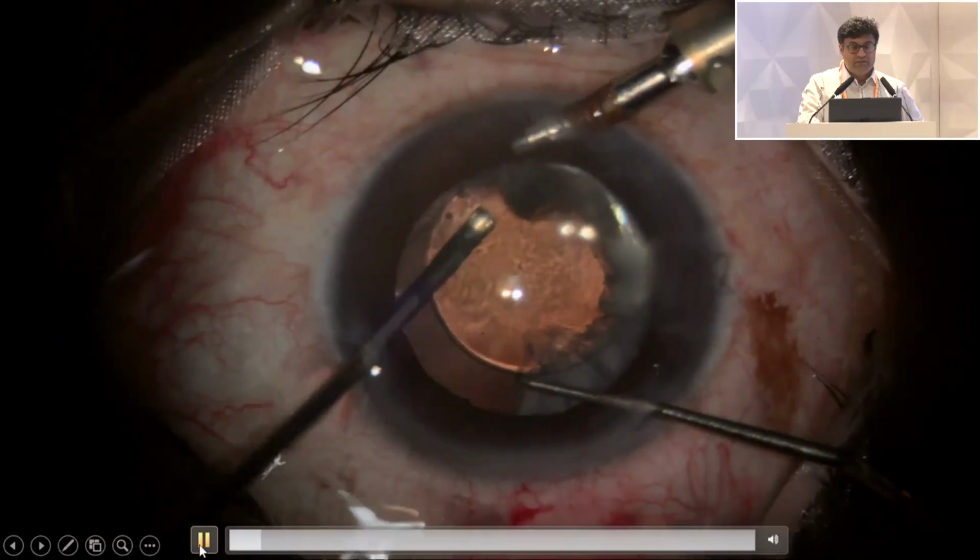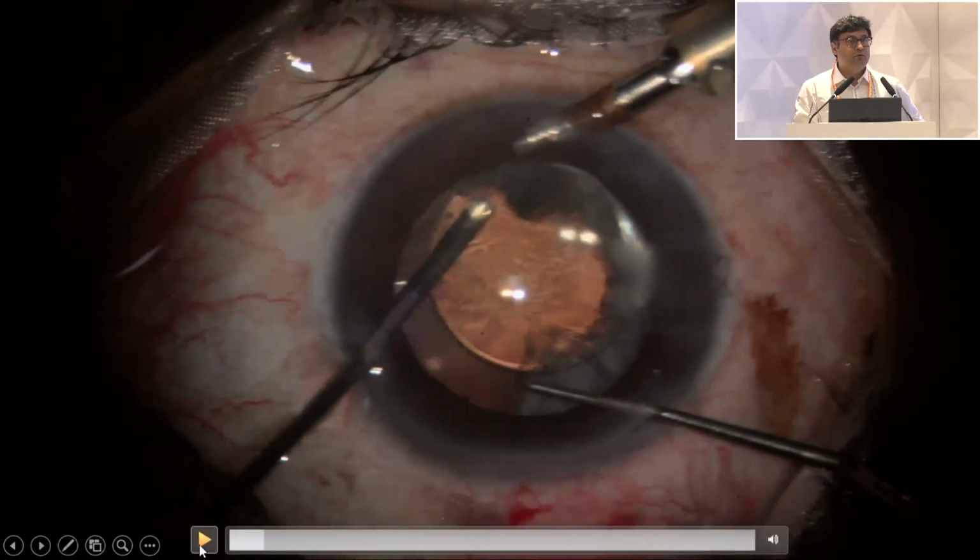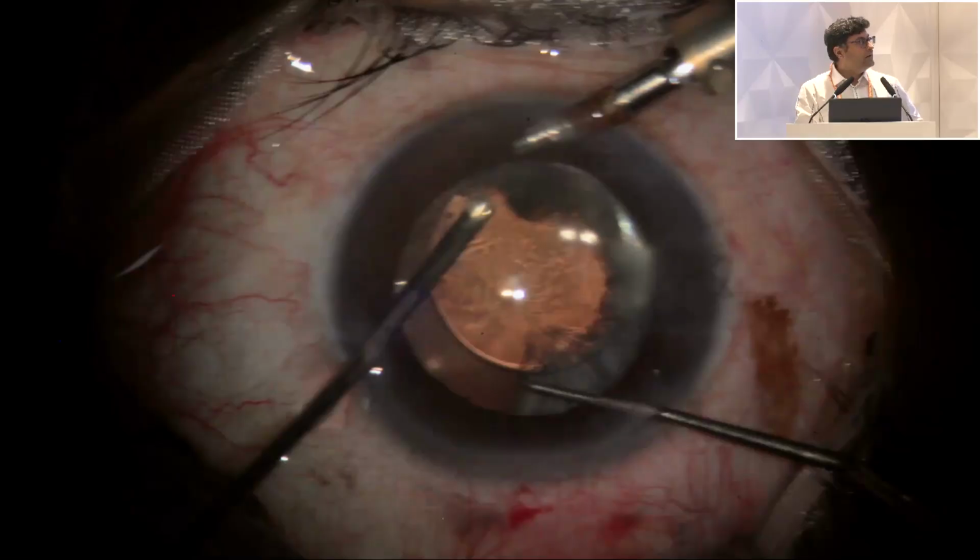Now this case, just look at this case. This is a case of a multifocal lens. The surgeon has implanted it into the sulcus and the lens is decentered. And there is a lot of cortex behind. This patient, despite having multifocality, is not going to see well because first of all, the lens is decentered. Secondly, the lens is in the sulcus. The patient is going to have a major refractive error.